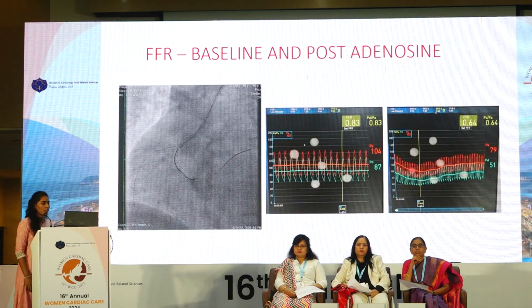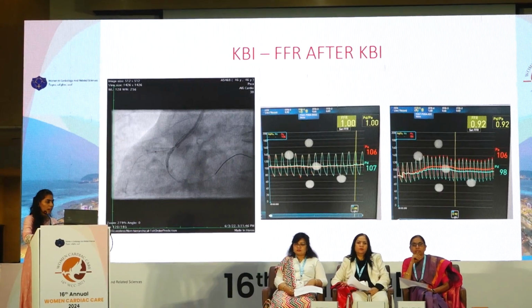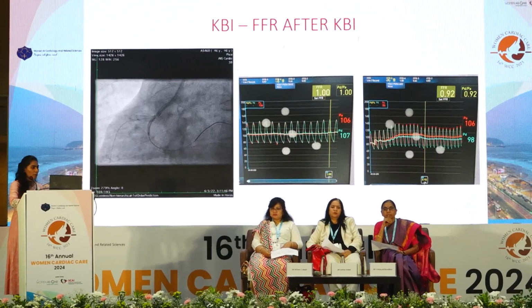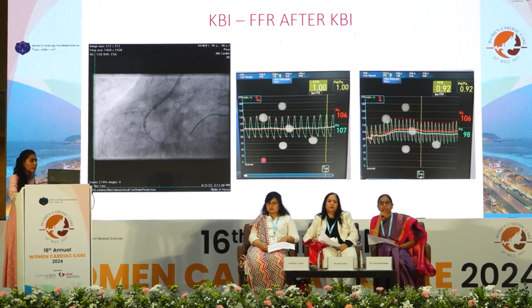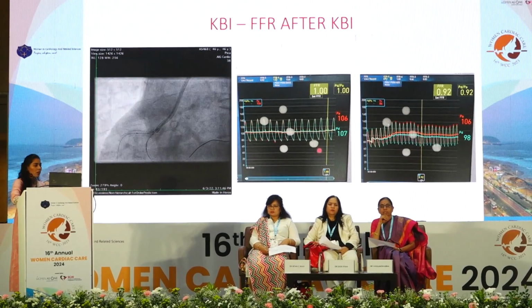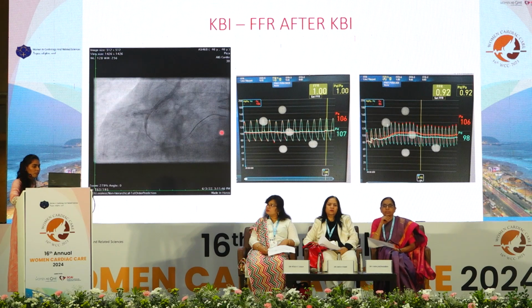Then we went ahead with FFR, which showed a baseline value of 0.83, and with adenosine it was 0.64, which was significantly positive. Then we decided to do kissing balloon inflation in RCA and LCX. We did kissing balloon inflation with a 3.5 into 12 mm balloon in RCA and a 2.2 into 12 mm balloon in LCX. Once the kissing balloon inflation was done, we repeated FFR, which showed a baseline value of 1, and with adenosine it was 0.92, which was significantly negative.